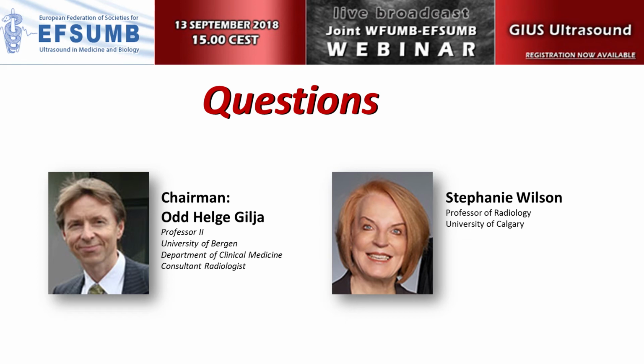That's a great question. And actually, I should ask the person from India that question, because of course they see so many more patients than we do. So I will tell you that I think we do not differentiate Crohn's disease and tuberculosis well. In my experience, we have had several patients, only a handful, who have had bowel resected for what looks like intractable chronic inflammatory change with increased stiffness on elastography, the whole match.